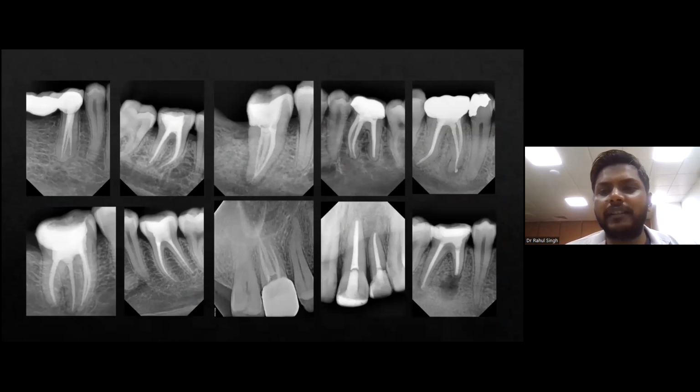My next slide will be the beginning of my topic, that is obturation. As you can see on your screen, the plenty of obturations that we do daily, although I have not put them all, but some of them give you a basic idea of what obturation is and how a tooth, after dealing with problems or after having a carious lesion or diagnoses such as apical periodontitis, SIPs, irreversible pulpitis, and whatnot. We do root canals for n number of reasons, either intentional or unintentional also.